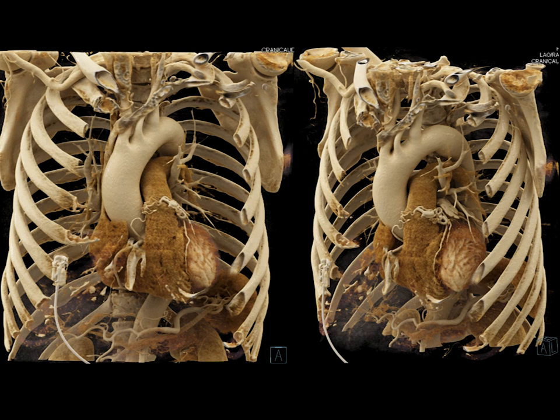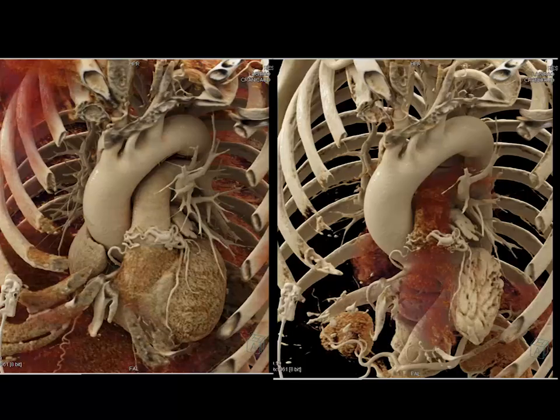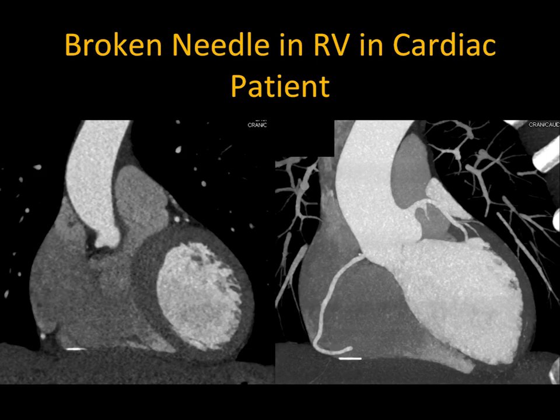It was a fistula from the coronary to the pulmonary artery. Look at the intricacies of those small vessels and how well you see them. You also can see how I can change the lighting model. Look at the detail of these images. Look how sharp and well defined the relationship of pulmonary artery to the aorta is, or the patient's coronary fistula to the pulmonary artery and aorta. You can see there are many things you can do.